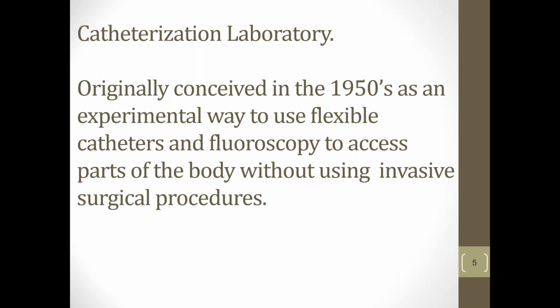Cath labs were originally conceived in the 50s as an experimental way to do less invasive procedures than what they could do back then. If you had an issue that needed addressing, the only way they could do it back then was to open you up on an OR table and do it really invasively. With the advancement of fluoroscopy and some enterprising physicians, they were able to come up with this idea of doing this type of procedure.